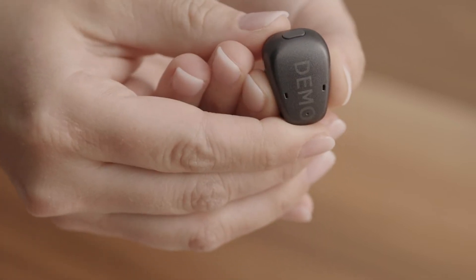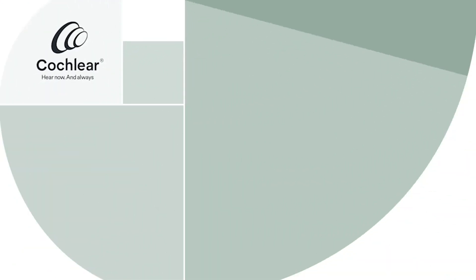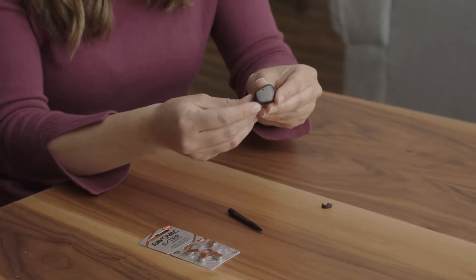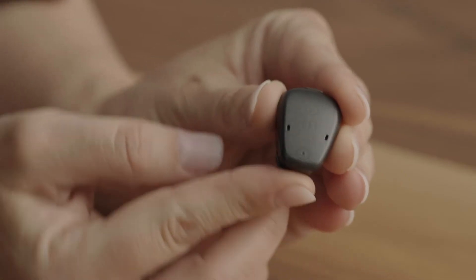To change your Baja 6 Max battery, simply open the battery door, remove the battery, and replace it with a new one from your battery pack. Wait 60 seconds before closing your battery door to optimize battery life. Our batteries provide up to 136 hours of battery life.